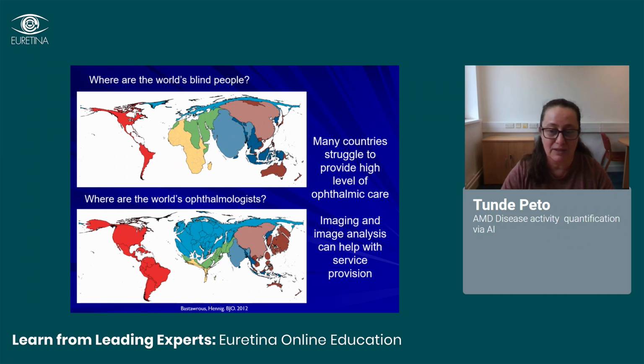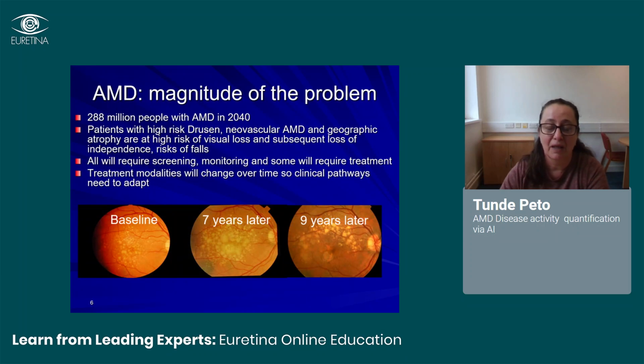And imaging and image analysis can definitely help with service provision as well. We will also be able to provide much needed help and service improvement to those countries that, as you can see at the very bottom, for example Africa or Southeast Asia, have very few ophthalmologists in proportion to the population. But a lot of these countries are now getting better and better in camera use, and they are able to take pictures of the back of the eye.